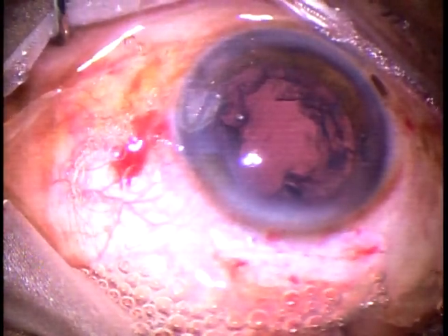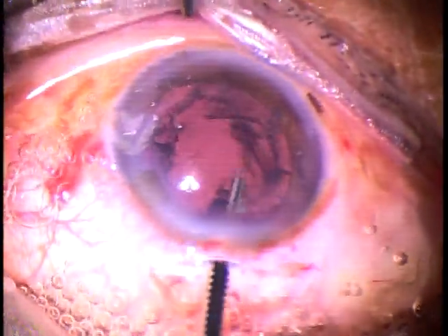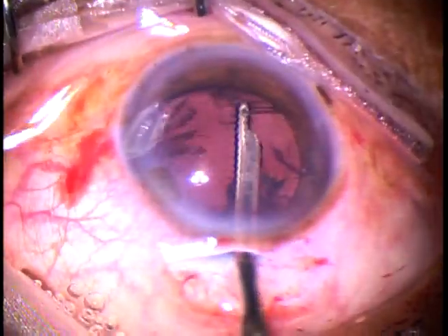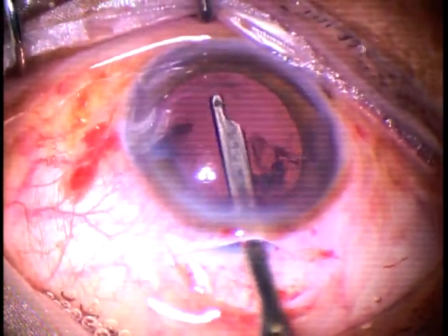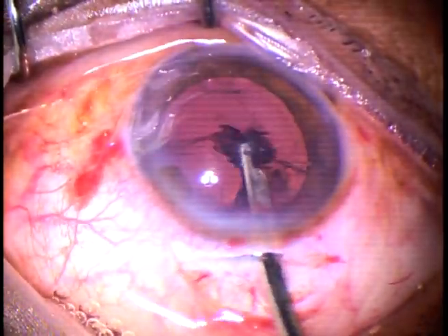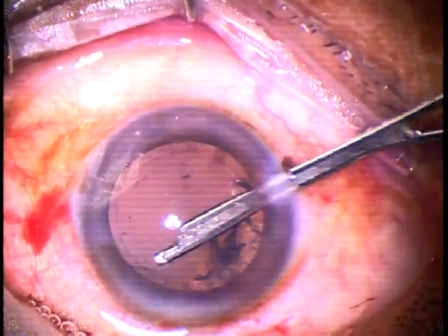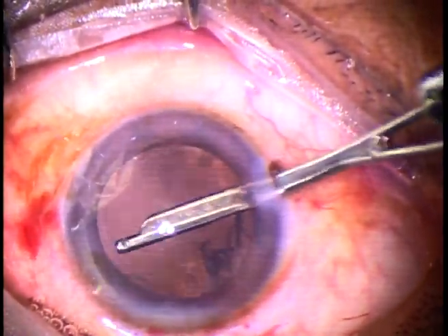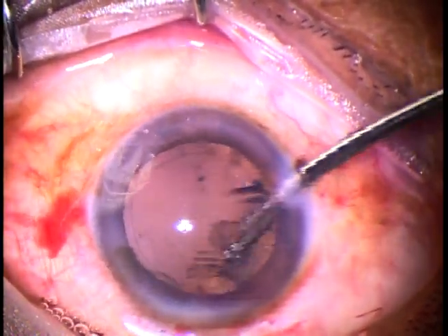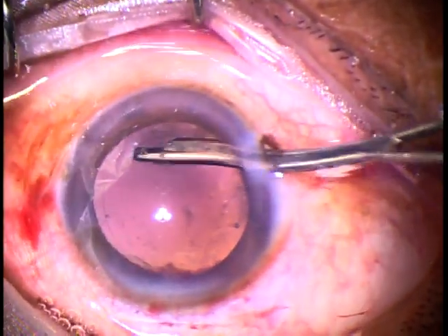Cortex is remaining and can be easily cleaned with a Simcoe cannula — this is a 23-gauge Simcoe. Most of the cortex from the inferior aspect has been removed. Going through the side port, we can remove the cortex from the upper part. The cortex has been removed very nicely.